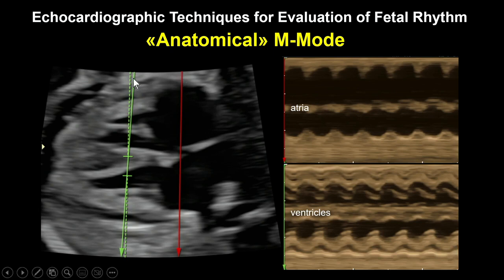Then the four-chamber view demonstrates the axial orientation, because the cursor is applied across the borders of the cardiac chambers, and we can visualize the maximal amplitude of motion of those chambers. That makes the tracing really improved, and you can clearly see and read those contractions from the atria and from the ventricles, which are conveniently highlighted by the color of the lines that we are applying here.